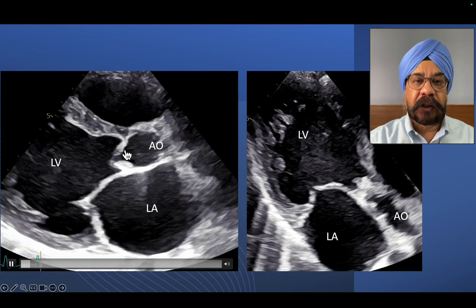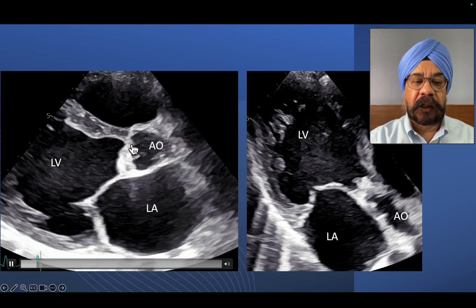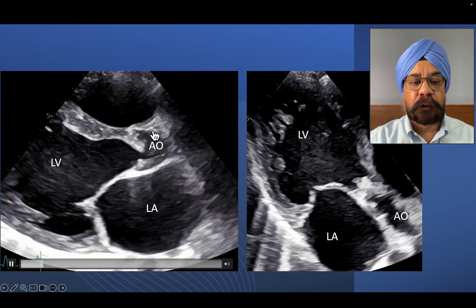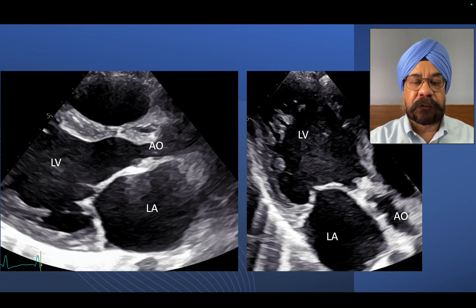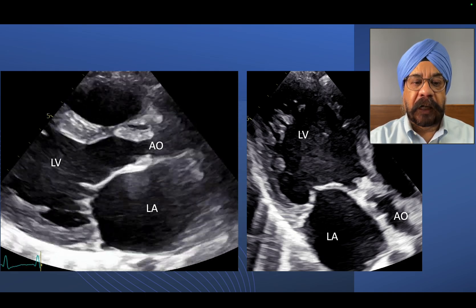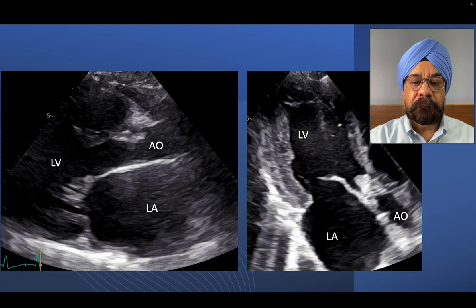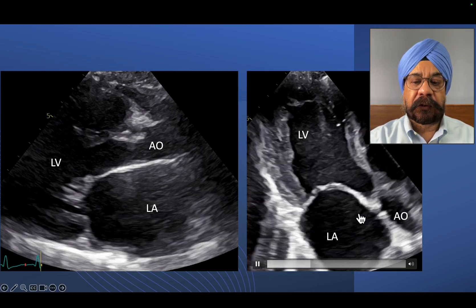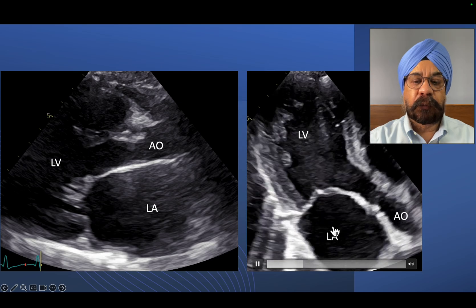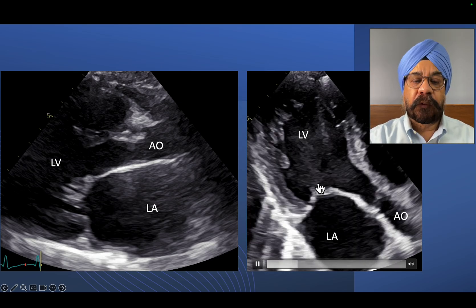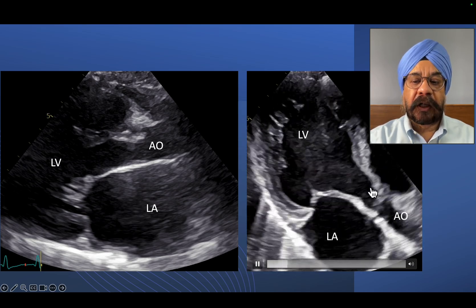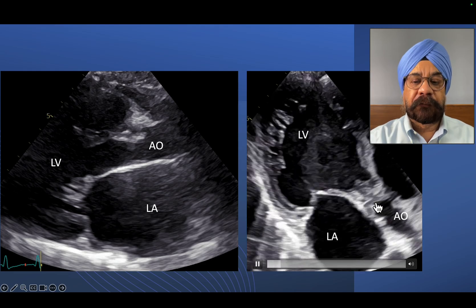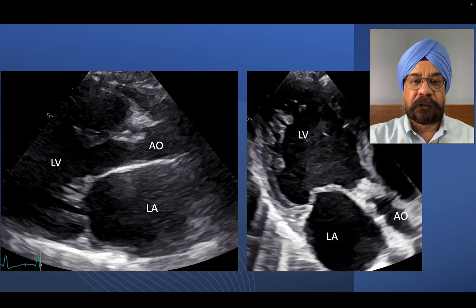You see the aortic valve is thickened. There are mixed echogenic foci which are prolapsing into the left ventricle, typical of vegetations or small masses on the aortic valve. Similarly, in the apical 3-chamber view, you see dilatation of both left atrium and left ventricle, hypo-contractility of the LV, and a mass prolapsing into the left ventricle — most likely a vegetation of the aortic valve.